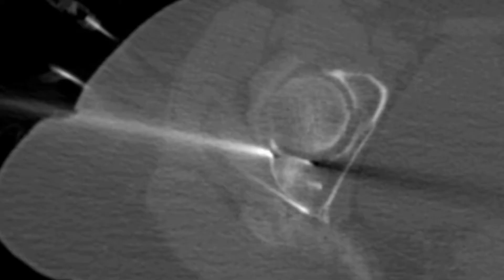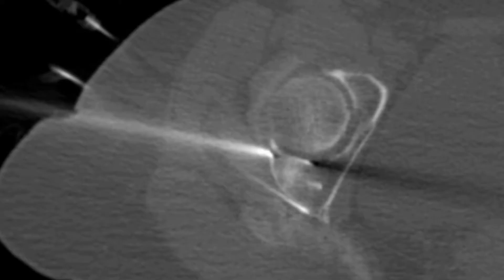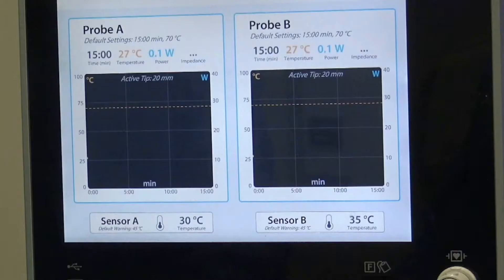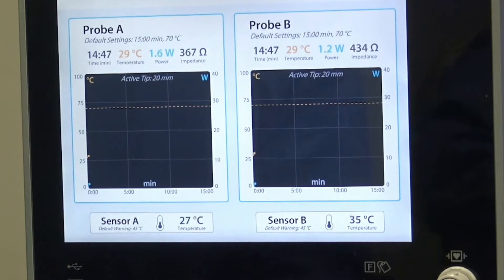An additional thermosensor was positioned posterior to the acetabulum, providing two securities regarding the sciatic nerve: hydrodissection that pushed away the nerve, and temperature measurement. Radiofrequency ablation can now be started. The target temperature was set to 70 degrees on both probes. The system displays the temperature given by the two optional thermosensors. The temperature at the tip of the probes is slowly growing with a ramp rate of 10 degrees per minute, with a target temperature of 70 degrees.